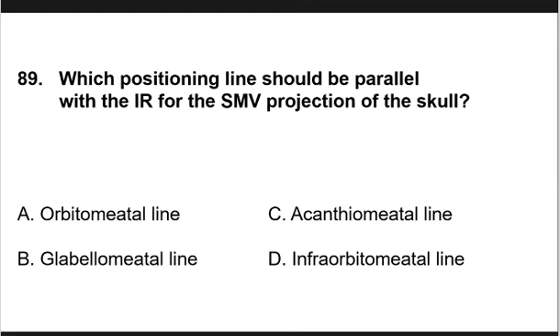So, ang sinabi nating IOML, infraorbitomeatal line, a line that connects from the inferior margin of the orbit to the center of the external auditory meatus. Inferior margin of the orbit to the center of the external auditory meatus. IOML yon.